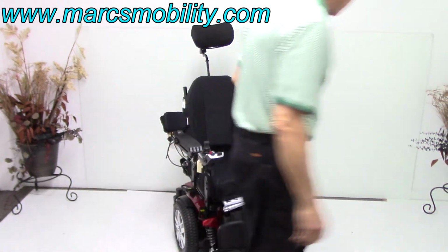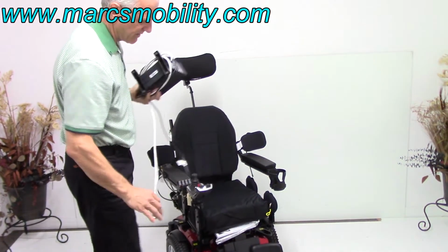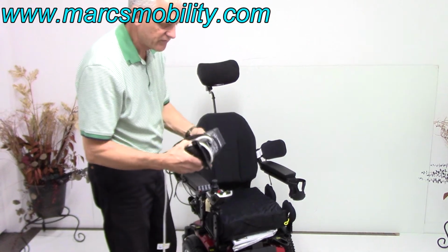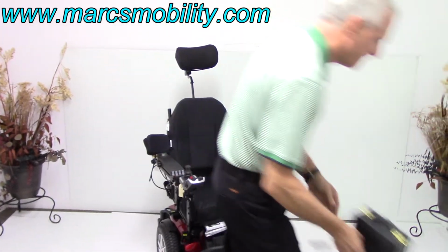And when you charge the chair, just take your Quantum charger, plug it in the bottom of your joystick, and as soon as the light goes from orange to green, you're full. When the charger turns green, it stops charging, so you don't have to worry about overcharging your chair.